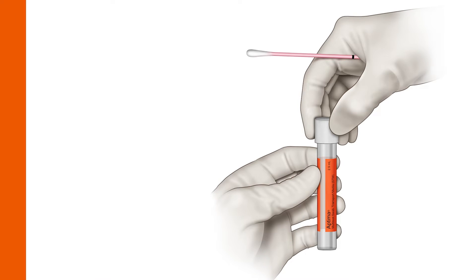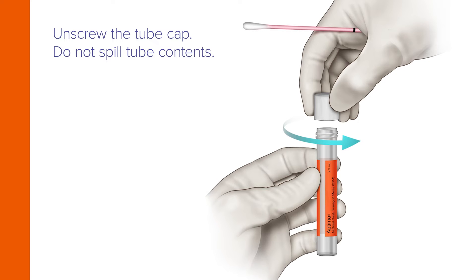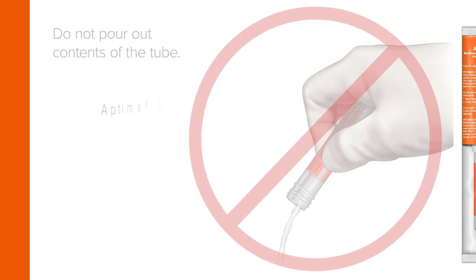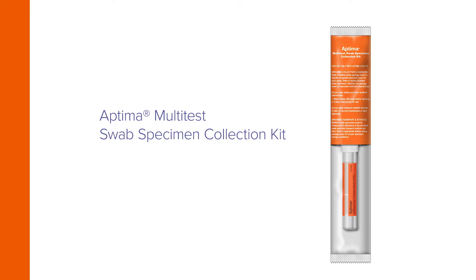While holding the swab in hand, unscrew the tube cap. Do not spill the tube's contents and do not pour out the contents of the tube. If the contents are spilled, discard and replace with a new Aptima Multi-Test Swab Specimen Collection Kit.